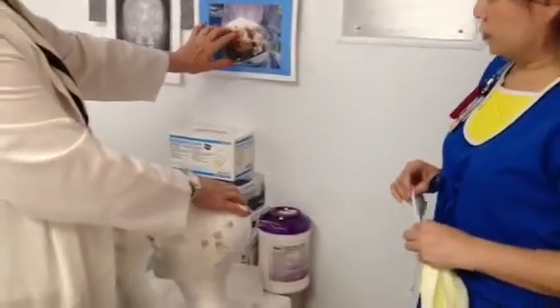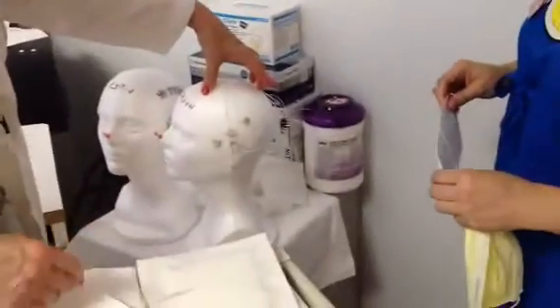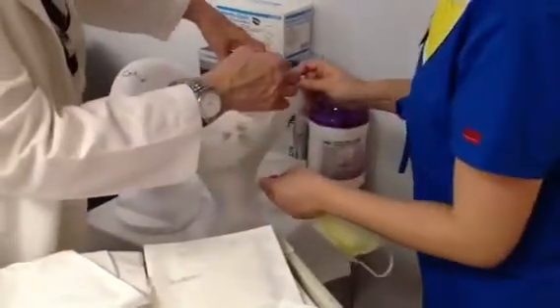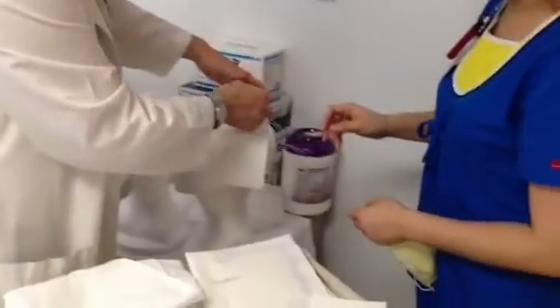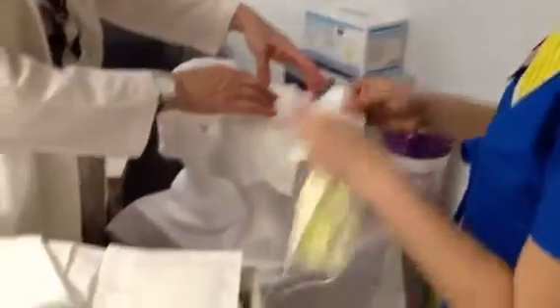You just clean it and go to the drainage and sort of cover it up with a 4x4, a couple of 4x4s. So you spread the 4x4s like this? Whatever hangs better. You'll see — you can be a little creative how you want to do that. Go to the other side.